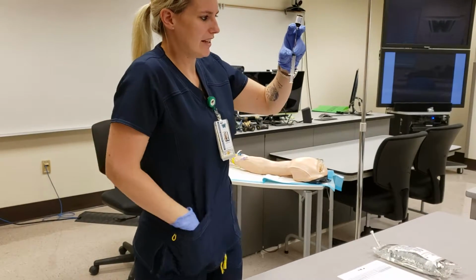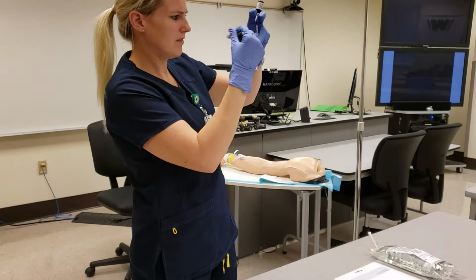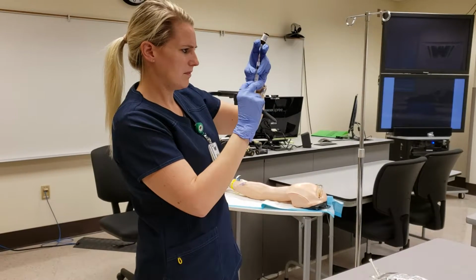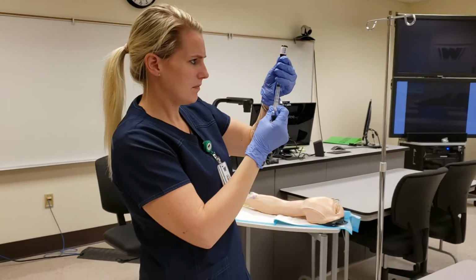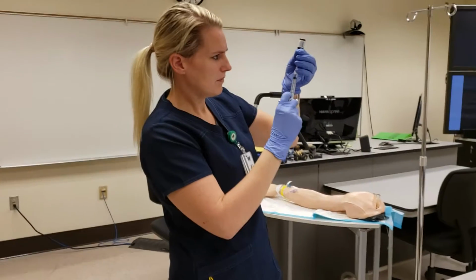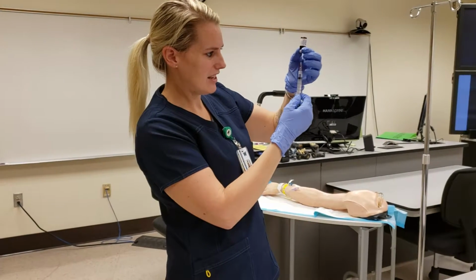So I would use my pen to get the air bubble out. So I'd make sure that all of the air bubbles are out, which they are.